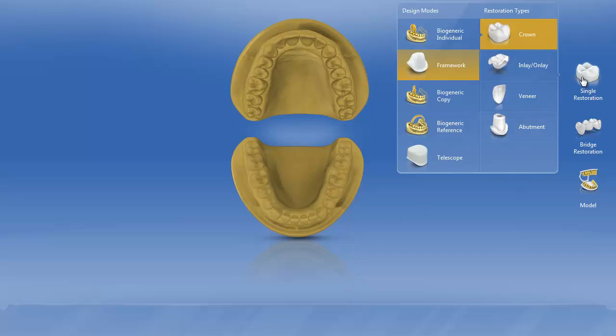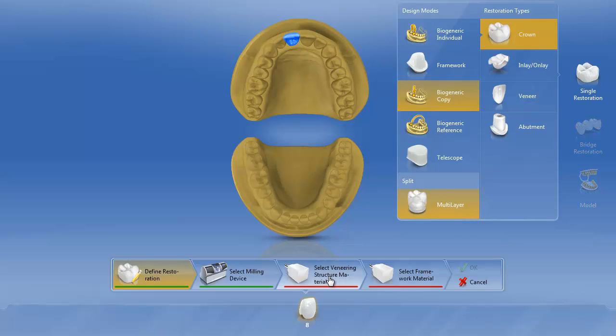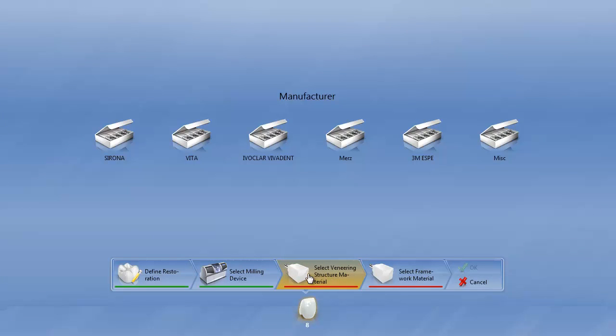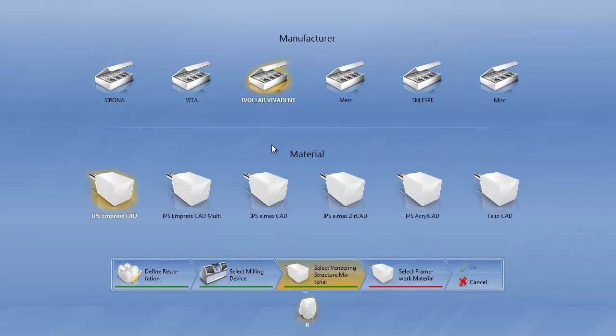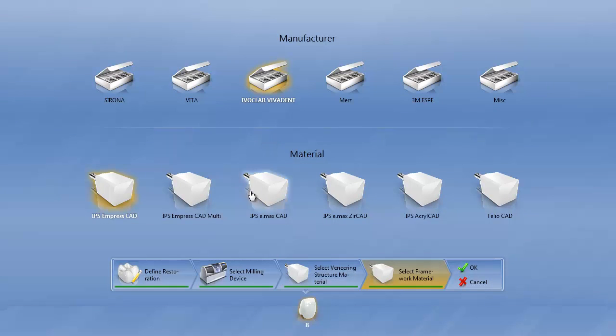We're going to do a single restoration. It's going to be biogeneric — in this case biogeneric copy — and we're going to do multi-layer. We're going to do it on tooth number eight. The veneering structure is going to be my final crown; we're going to do that out of Emax — this could be Emax HT or Emax LT. The framework is also going to be out of Emax, but we're going to do this out of Emax MO, or medium opacity, and we'll hit OK.